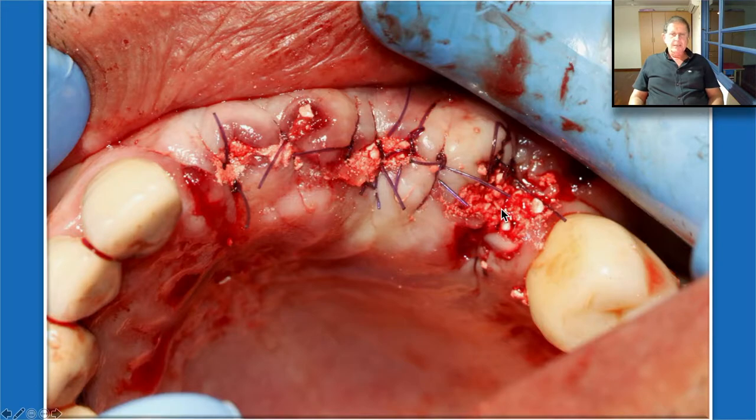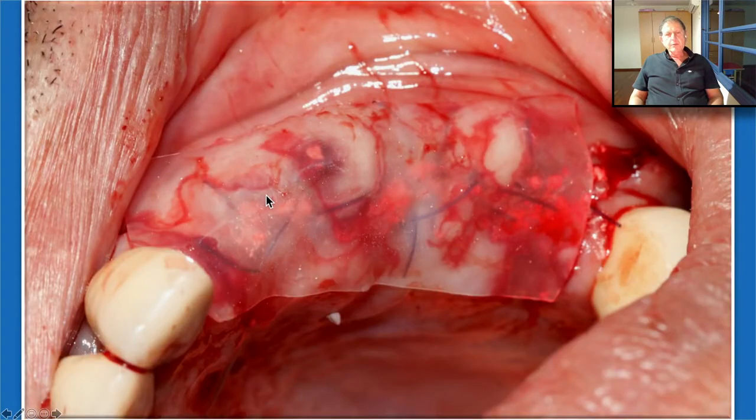We just make a minimal flap reflection, stretch it, and even if it will not be closed perfectly, there is absolutely no reason to be scared — soft tissue knows how to proliferate above the graft, especially when we have the Oraid giving wonderful protection so the material will not wash out. Normally, Bond Apatite can be left exposed 3 mm without any problem. However, with the protection of the Oraid, it can be a little bit more with no fear. In sockets, sometimes we leave it 10 to 14 mm exposed.